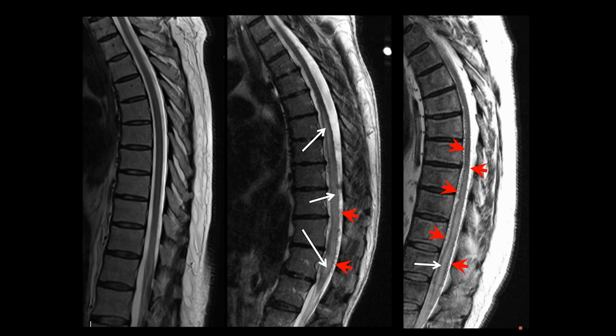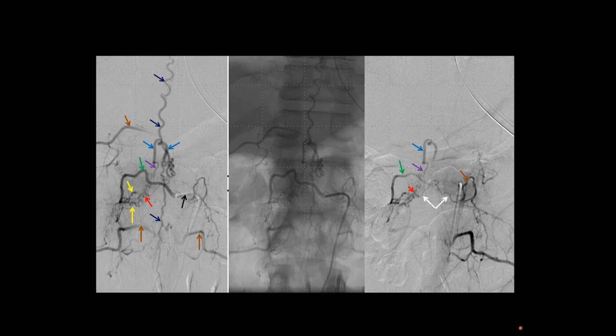This is the appearance on angiogram, when we identify the level of the fistula. This is the catheter here injecting the dye. This is the segmental artery, and the fistula is here where the red arrow is. So here is where the artery becomes vein, and then the vein finds its way through the spinal cord. What we see opacifying here are the veins surrounding the spinal cord. And because of this increased pressure in the vein, the spinal cord will suffer from venous congestion.